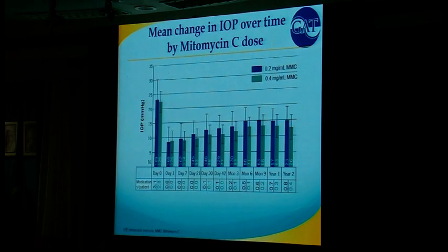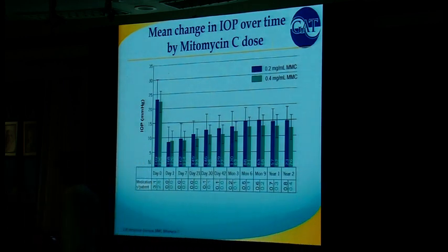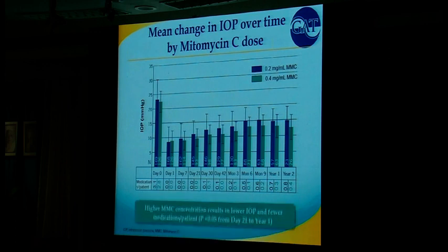And this slide kind of demonstrates that the higher dose of mitomycin C, the better the outcomes, and the less likely the patient is going to be on drops. In Canada, Ike Ahmed is doing a lot of these, and he's injecting mitomycin C, and he's really pushing the limit as far as how much mitomycin C he's using. He's using 150 to 200 micrograms of mitomycin C. It's a huge, huge dose that he's found to be pretty safe and effective. So I think this is an exciting thing that's coming down the line to help us further standardize surgery.